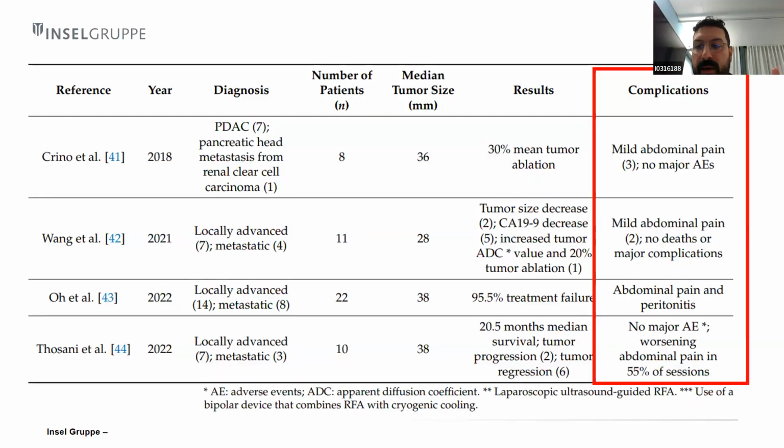Of course, thermal ablation can lead to inflammation with fibrotic and cystic transformation. And among the potential adverse events of pancreatic RFA are pancreatitis, gastric wall injury, bowel injury, pancreatic duct injury and stricture, and bile duct injury, leakage, as well as, in the worst cases, peritonitis.